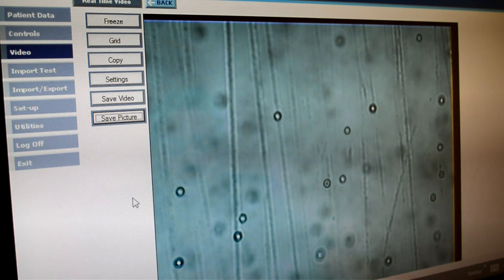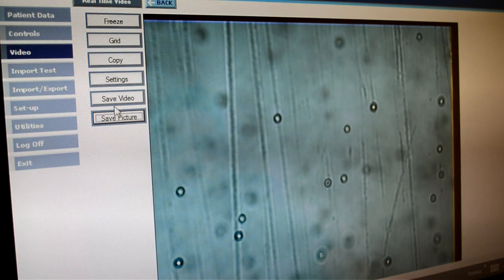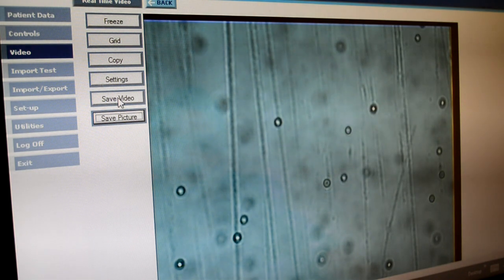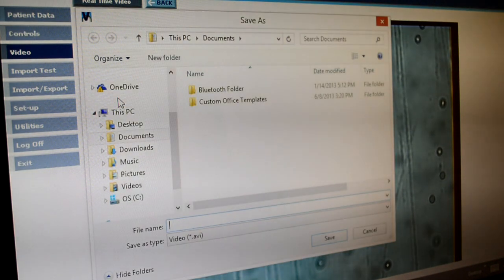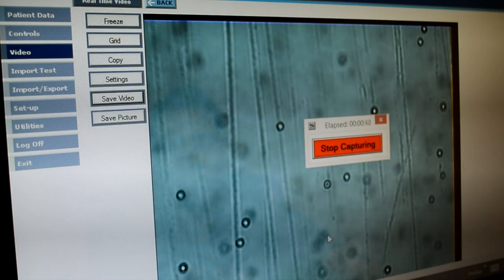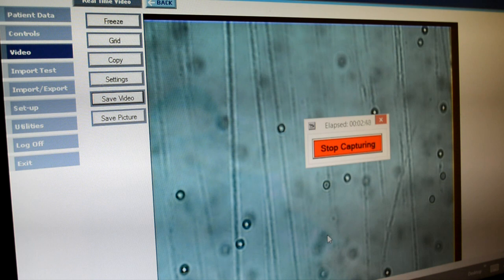You also have the option to record a video of the sample by clicking save video, second option from the bottom. Again, you'll name the file as you choose and click save to begin the recording. The image is now being recorded.